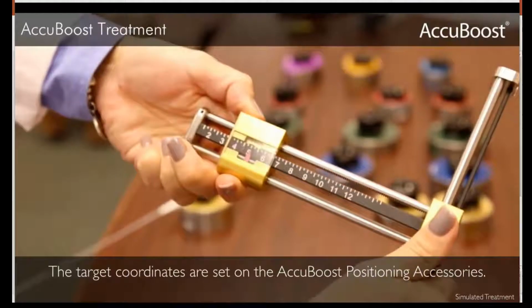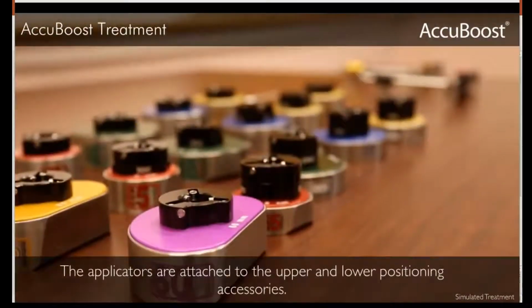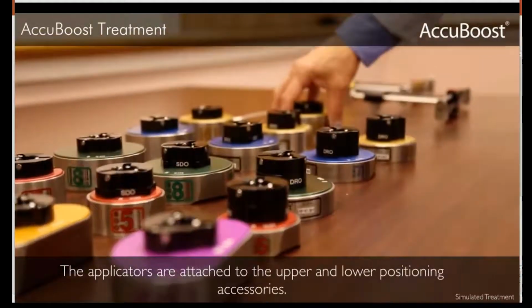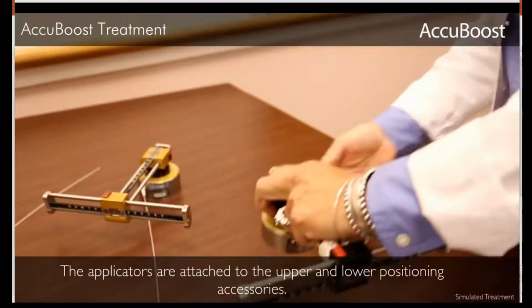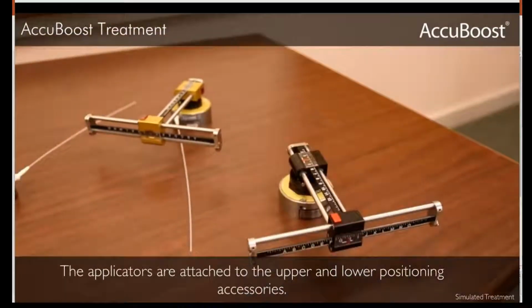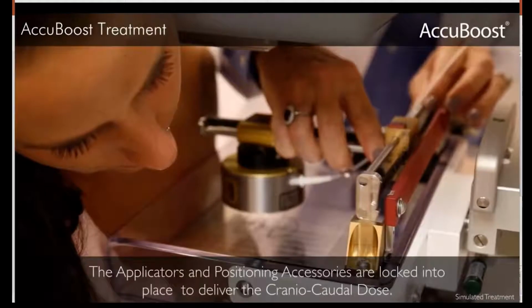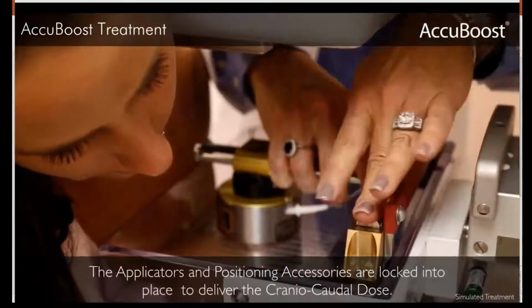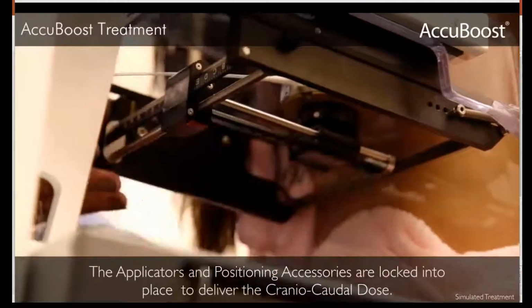And that's what's happening here. And then, as you see, there's a wide range of applicator sizes and shapes, and we'll talk about that in the webinar in terms of the selection. These are snapped into place on the compression plates above and below the breast.